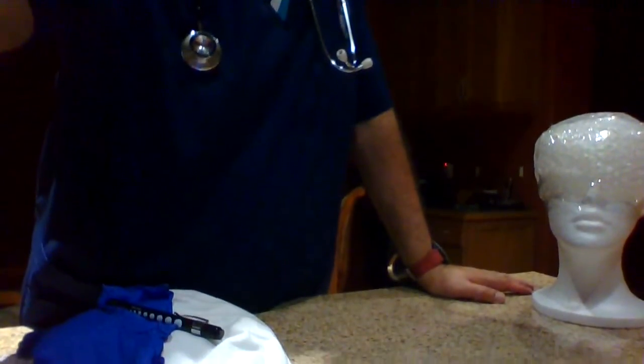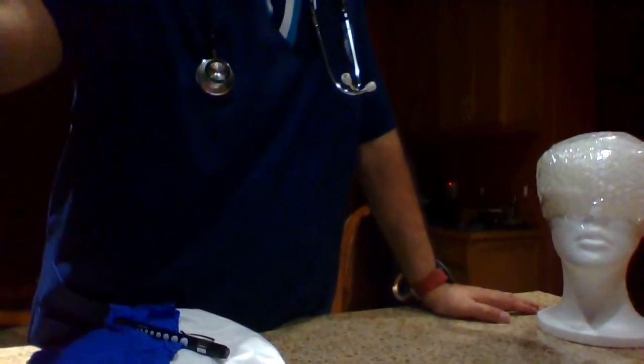Great. So before we actually begin the procedure, we're going to make sure of patient privacy and environmental safety, and make sure everything's where it's supposed to be and working properly. So now, make sure this camera is working.